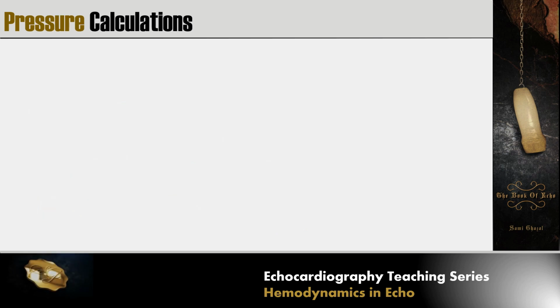Now we'll shift gear and talk about pressure calculations. So pressure calculations are based on the Bernoulli equation. And we already talked about the Bernoulli equation in the physics. The pressure gradient is the difference of pressure between two chambers. So for example, let's say this is the RV here.